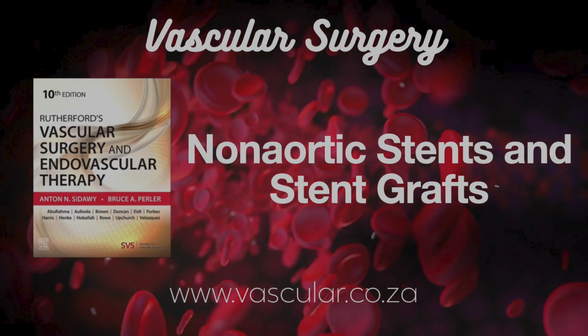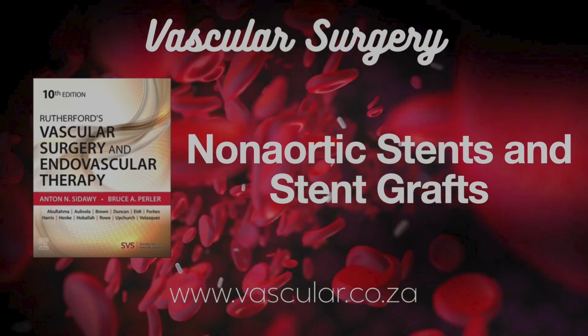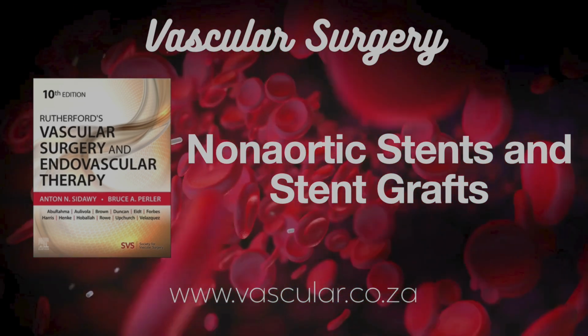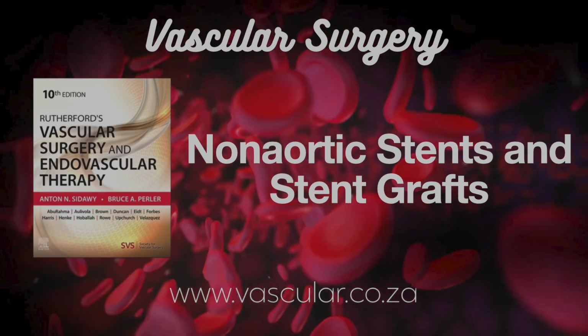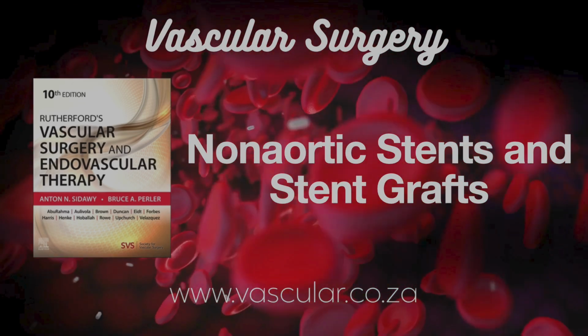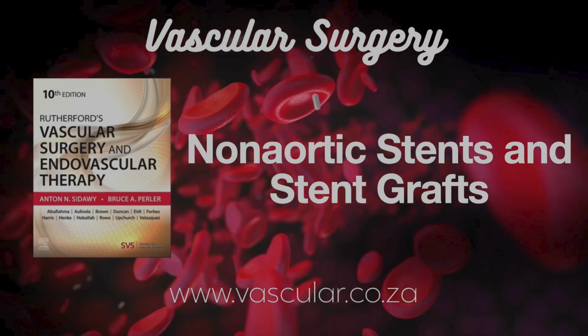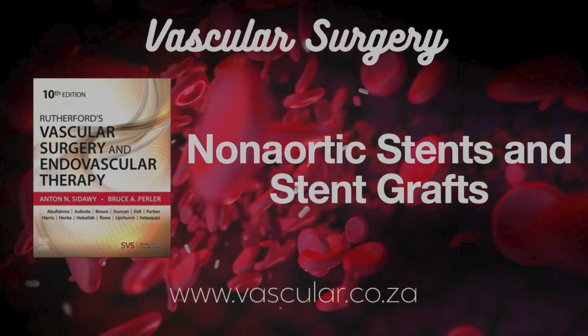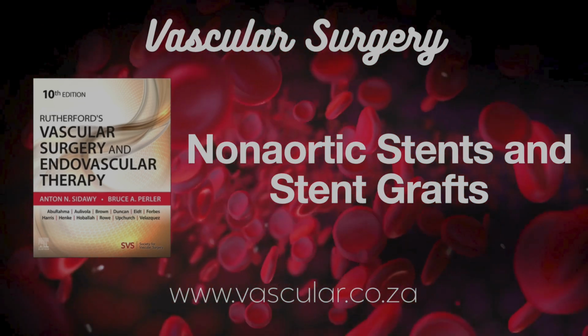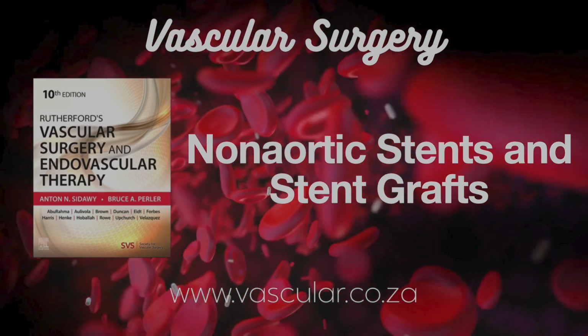Why avoid stenting there? Two big reasons. You might block off the profunda femoris artery, which is critical for thigh circulation, and it's a key access site for lots of other procedures, so surgery is often preferred there. And further down the leg, like the SFA or popliteal? Stenting there is usually reserved for when balloon angioplasty alone doesn't work well or fails quickly. The long-term results aren't always better than just angioplasty.